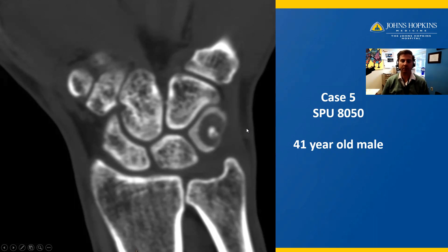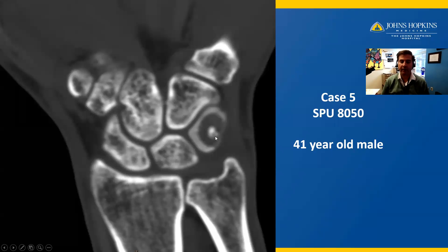Case number five is from a 41-year-old male. Here we have a CT scan in a coronal view in a bone window showing an interesting mass in the triquetrum carpal bone. The black corresponds to a lytic process, and centrally there is this white nidus, a central nidus corresponding to sclerotic bone in the background of a predominantly lytic process with circumscribed edges.